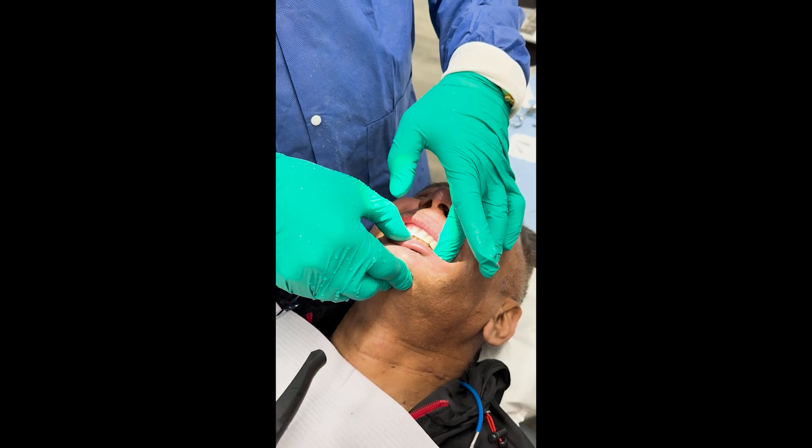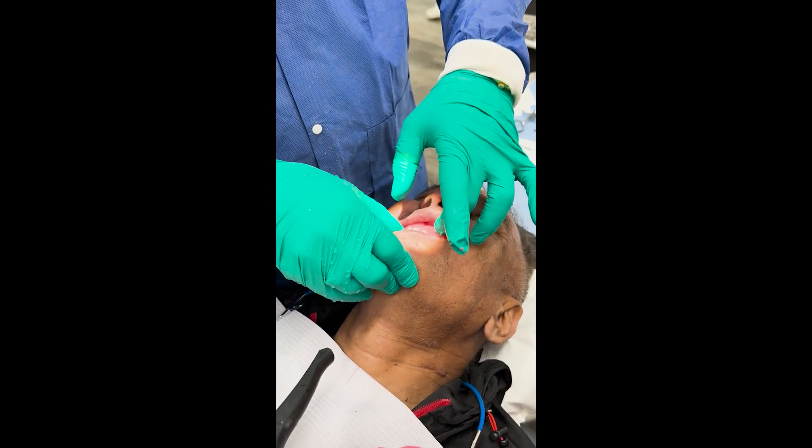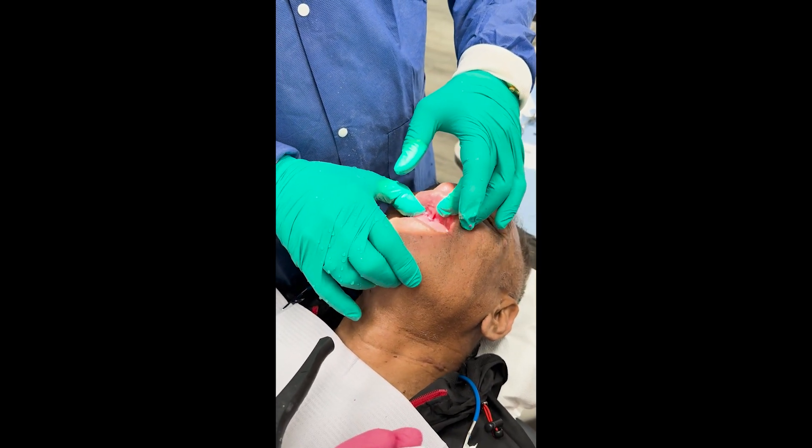Bite together and just hold that for a couple minutes. You can wipe off any excess here.